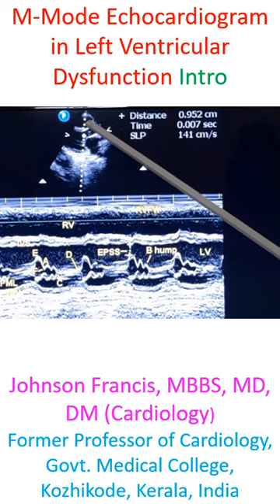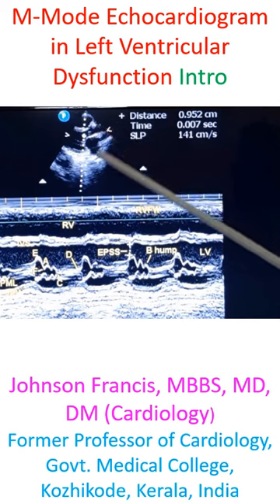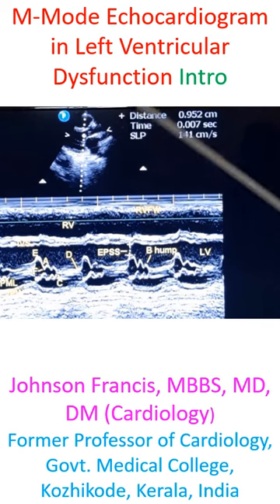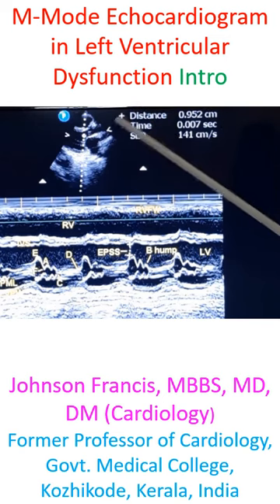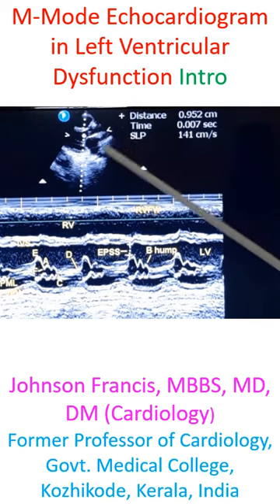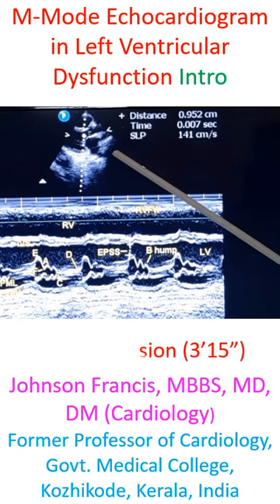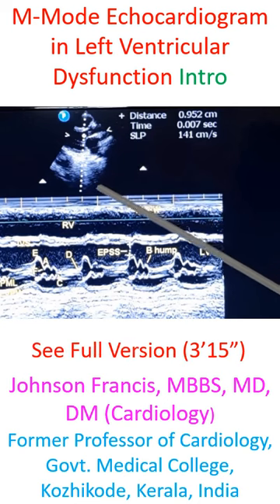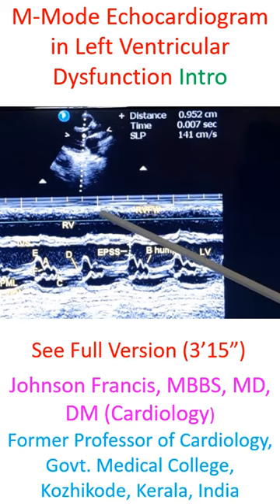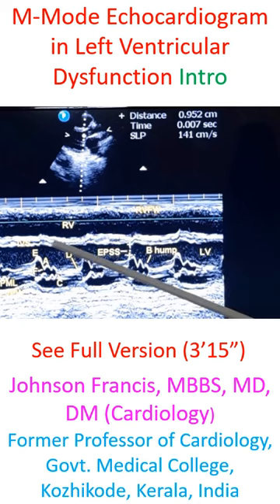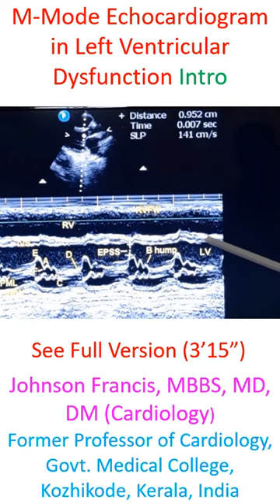The RVOT — right ventricular outflow tract region — is also dilated. There is probably associated pulmonary hypertension as well. But in this view, we will not be able to comment much on the right ventricle. This is the right ventricular free wall. This is the interventricular septal motion.